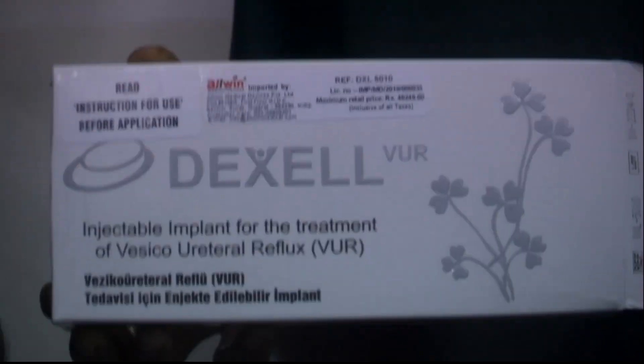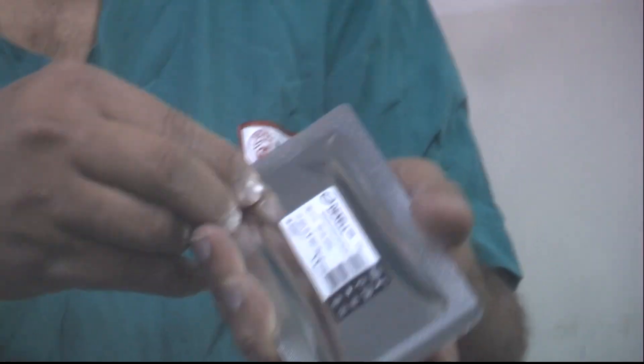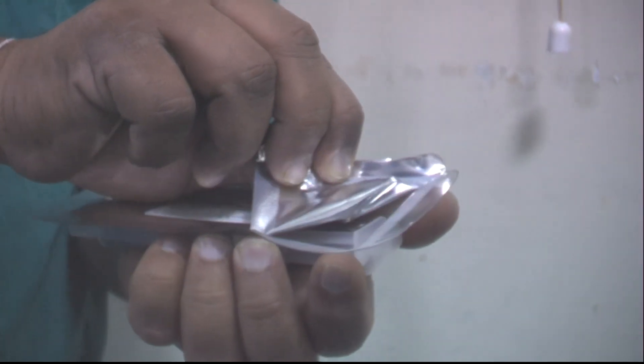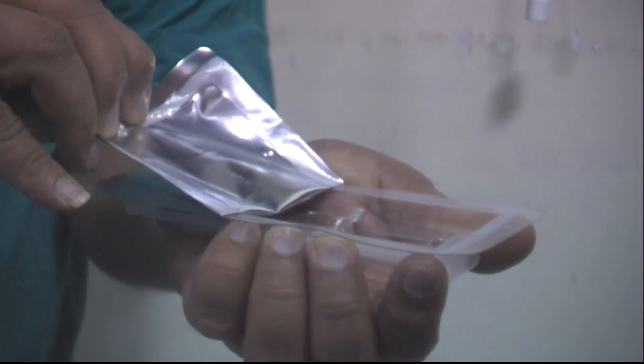Dexel is basically a compound that is a combination of dextranomer microspheres along with hyaluronic acid gel, and it comes in the form of a pre-filled 1 ml syringe as we can see here.